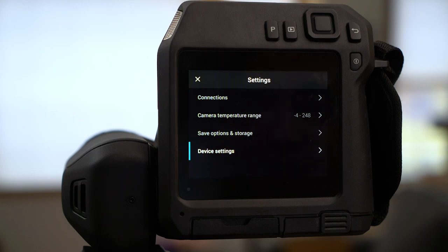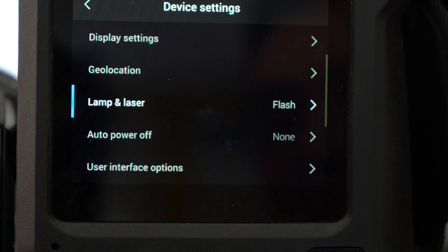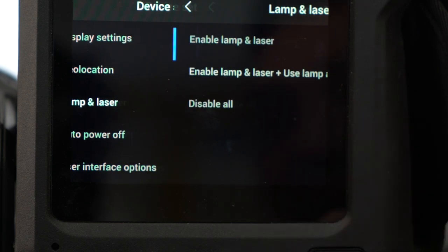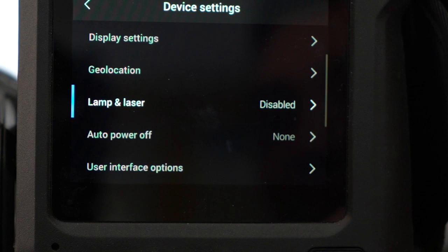Click the gear icon to take you to settings. Tap device settings, then select lamp and laser. Select disable all to deactivate the lamp and laser.